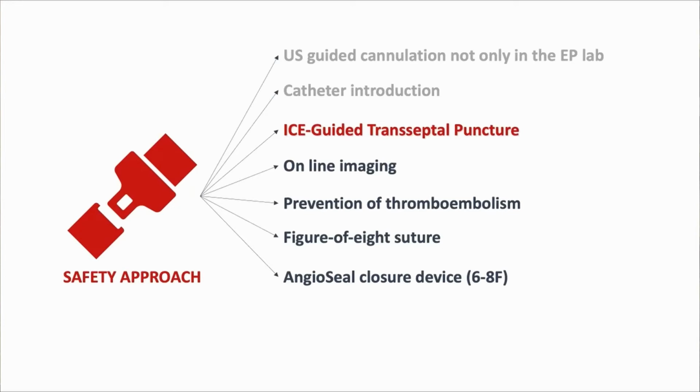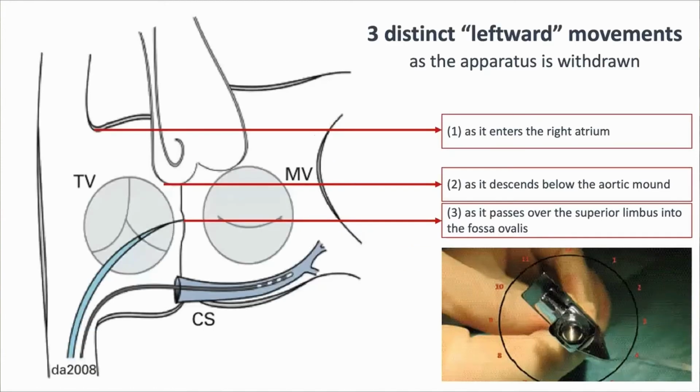The key to a successful catheterization of the left heart chambers is the safe transseptal puncture. Intracardiac echo is an attractive tool used in cardiac catheterization and EP labs to provide detailed images that can facilitate transseptal puncture. Not using imaging modalities to ensure needle position may result in accidental puncture of the aortic artery or the atrial wall, sending the patient into cardiac tamponade.